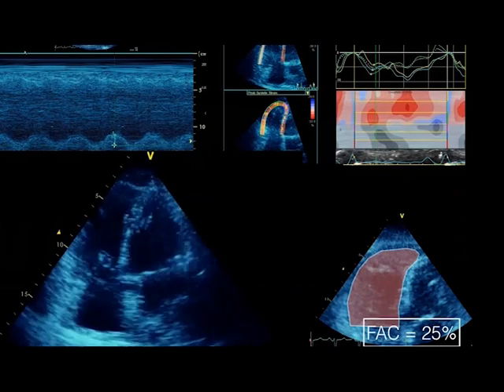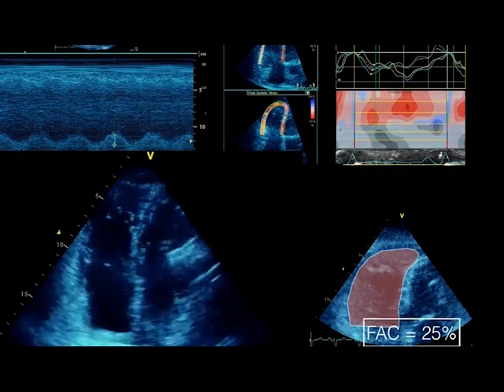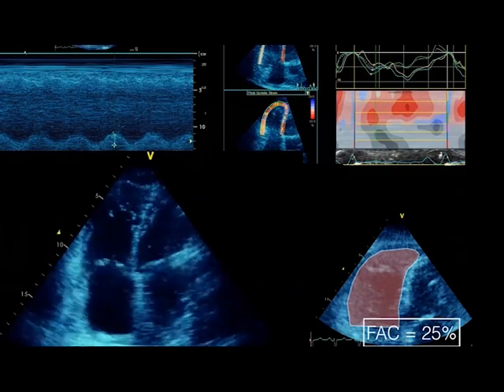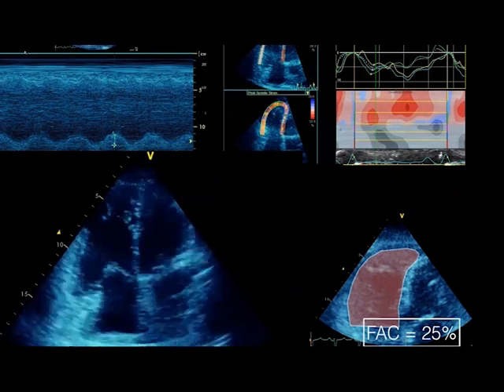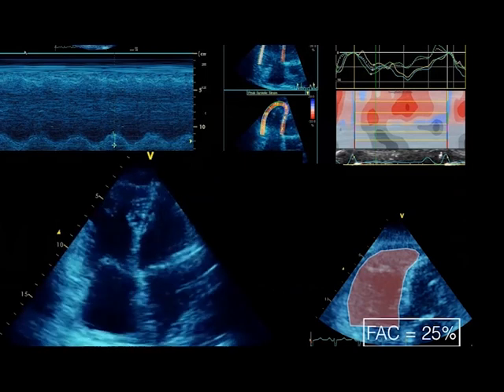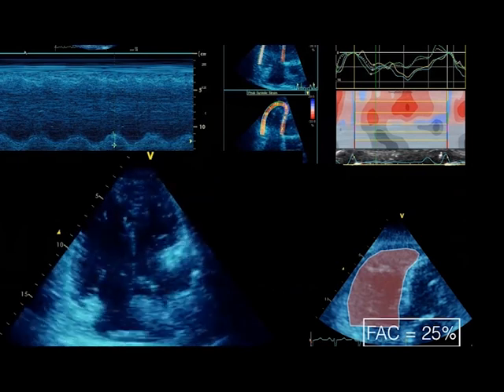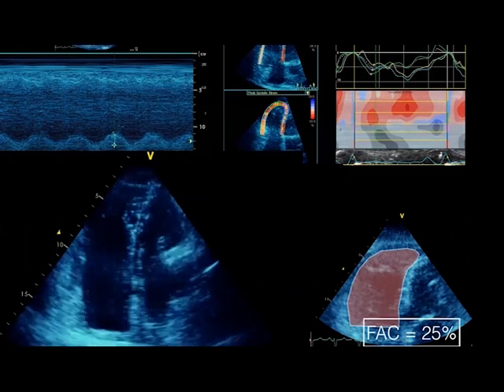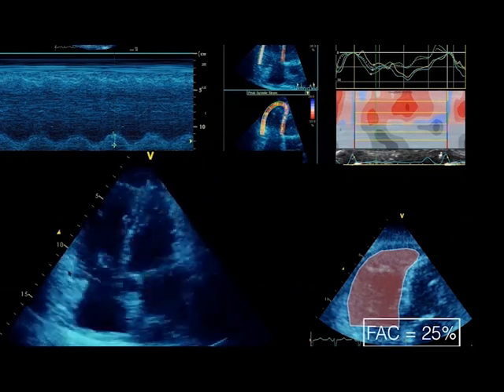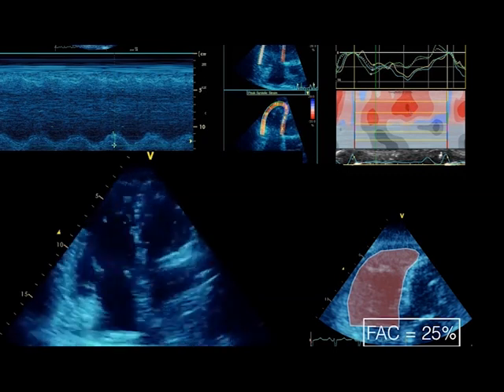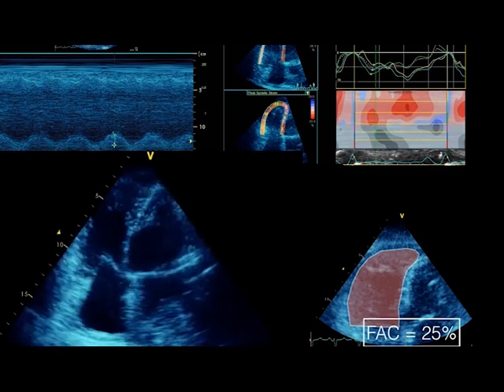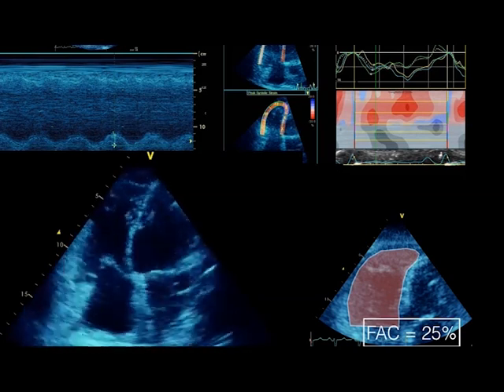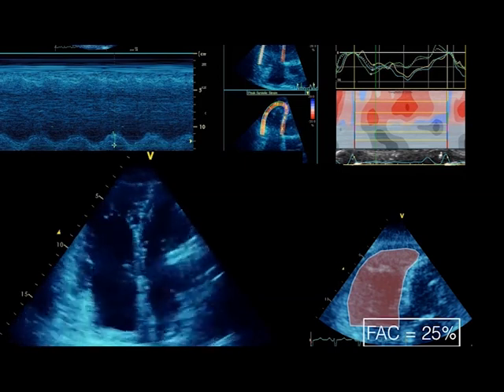The low tricuspid regurgitation velocity is because RV function is down. We assess RV function with TAPSE, tissue Doppler, fractional area change, and subjective assessment. This is what a badly functioning ventricle looks like. For more research-based assessment, one of the more sensitive methods is speckle tracking to look at right ventricular free wall strain.